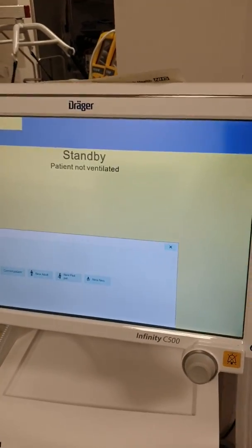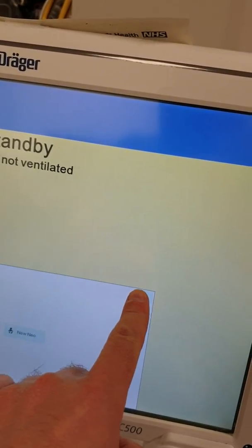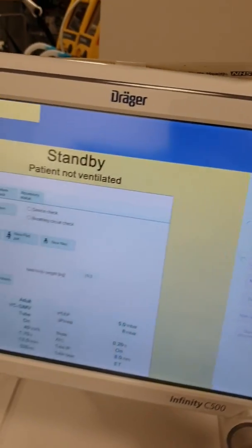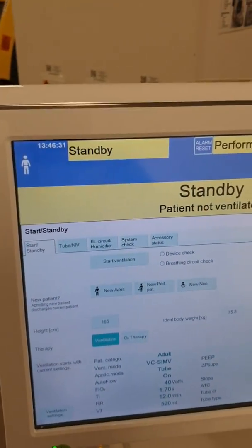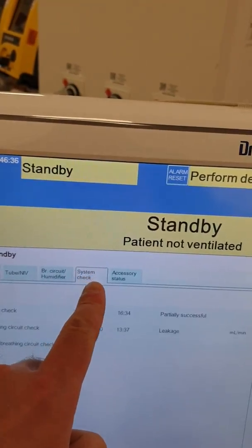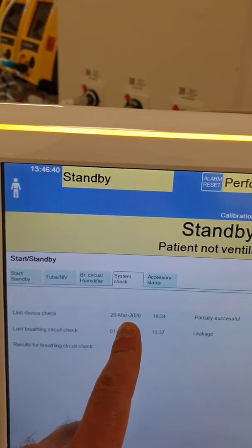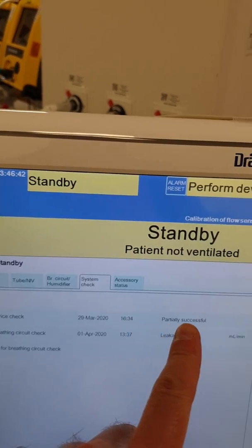So this is the initial screen and we just need to close this window. Now what you need to do is have a look in the system to check if the device check has been done recently. It's the 29th of March and today's the 1st of April, so that's fine.